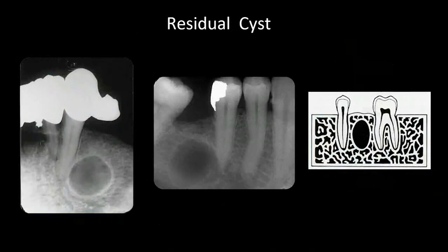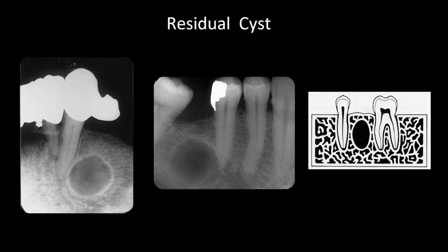Here's a beautiful example of a residual cyst. When a tooth is extracted but a radicular cyst is left behind, it's called a residual cyst. You can see it's very well-defined and corticated — a nice white line around it — indicating the body has been able to wall it off, with diseased tissue right next to healthy tissue. It's definitely hydrostatic in appearance.